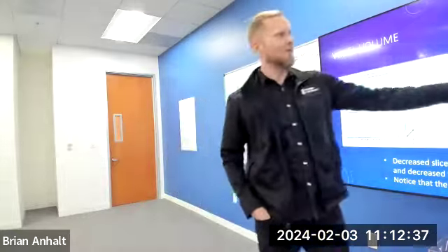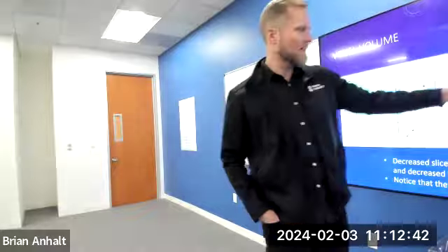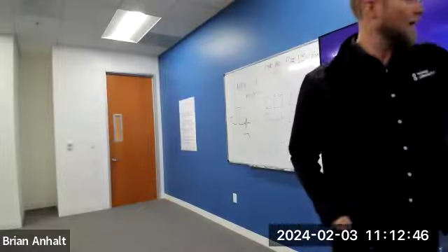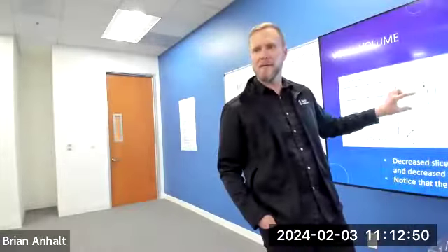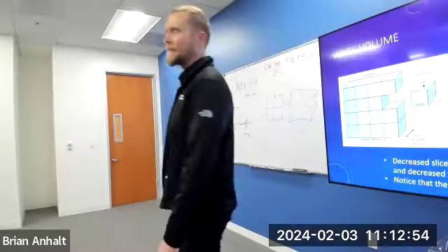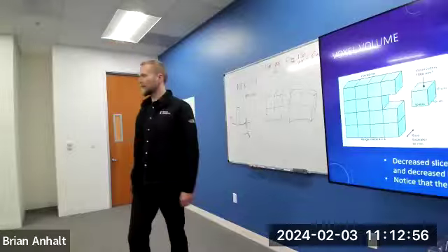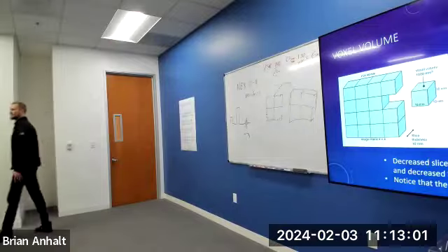What happens if we halve our slice thickness to 5? Our pixel area is still the same, right? It's 100, 10 by 10, but now we multiply it by 5. We can already see this is a much smaller box than this, right? Our voxel volume is 500 millimeters cubed. It's half of what it was before. What do you think happened to the SNR? By how much? Half.